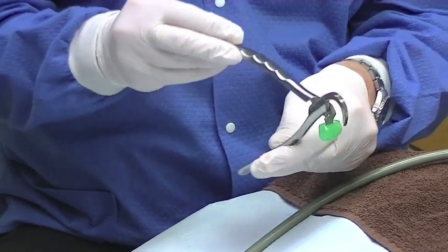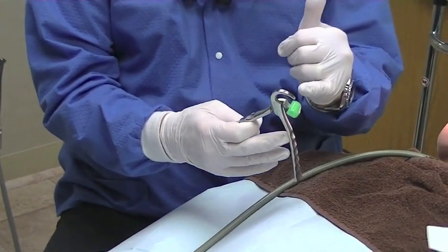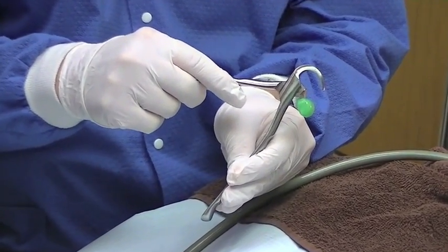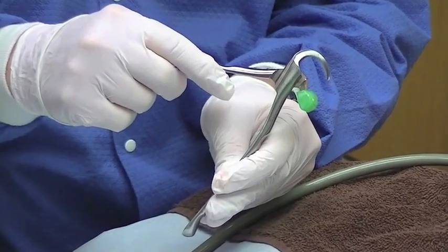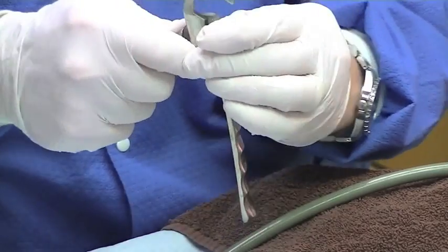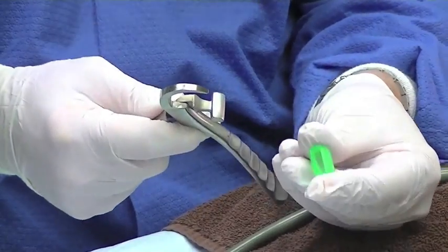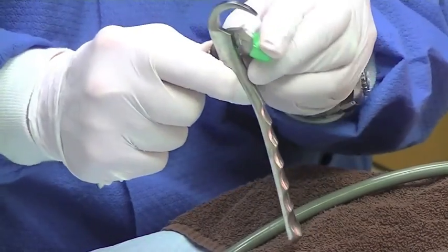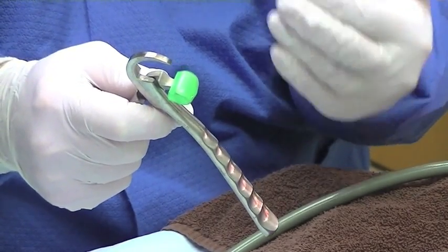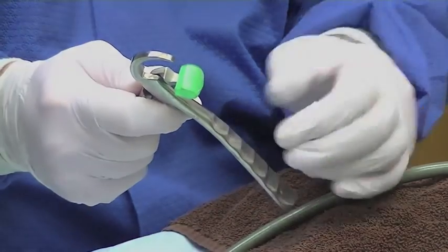We've sedated our patient today, so if you hear a little snoring, you'll understand what that's all about. With all the forceps, we have what we call a beak, which is a flattened end that will engage the lingual or palatal aspect of the tooth. Then we have what's called the bumper — a little silicone piece that is easily removed and replaced as needed. It provides comfort towards the tissue, and the bumper will be placed as high or down the vestibule as possible, by the mucogingival line angle.